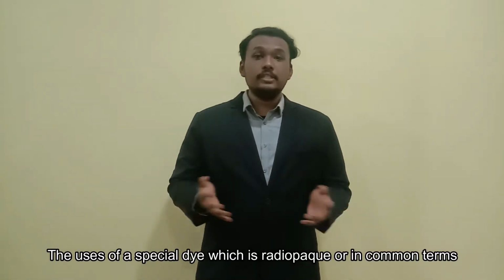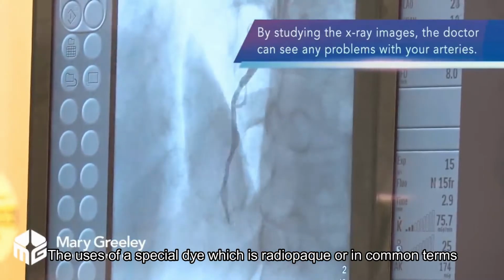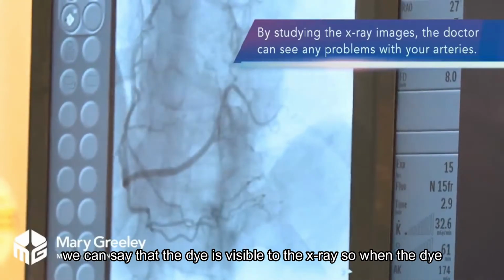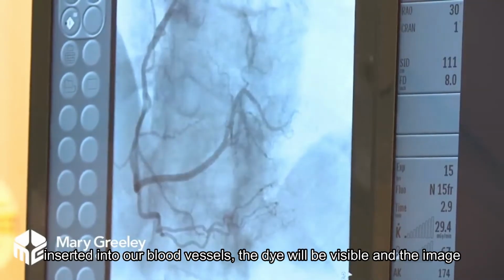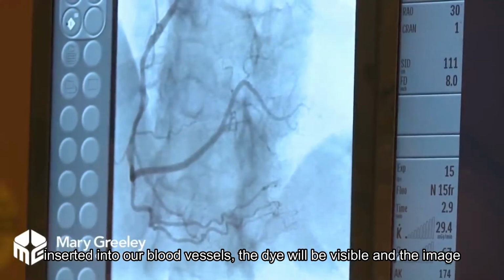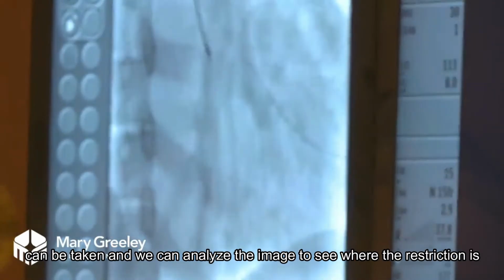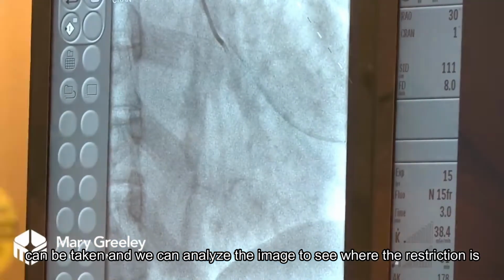They use a special dye, which is radiopaque, or in common terms, we can say that the dye is visible to the X-ray. So when the dye is inserted into our blood vessels, the dye will be visible and the image can be taken, and we can analyze the image to see where the restriction is.